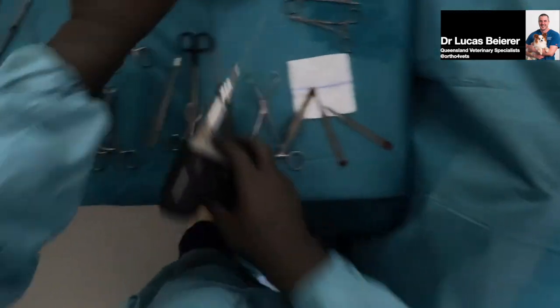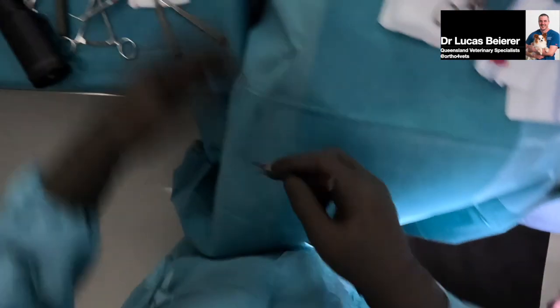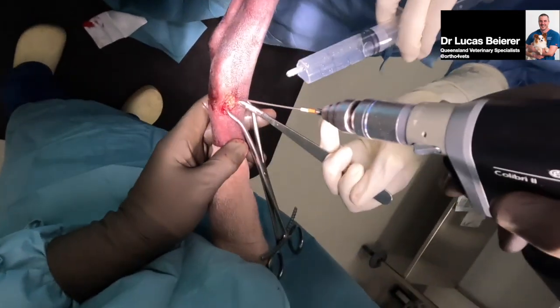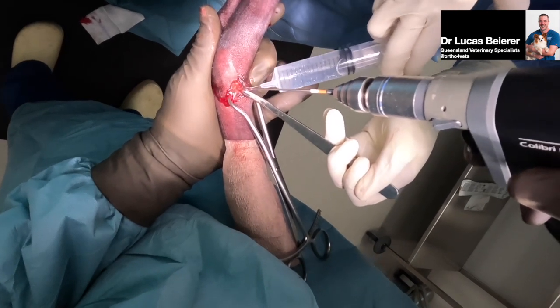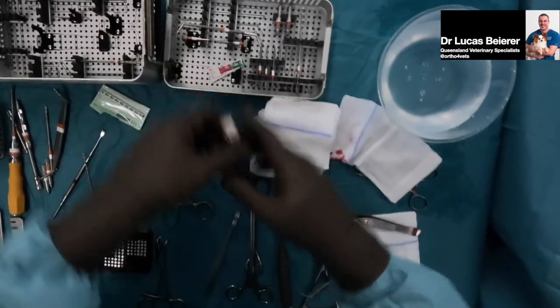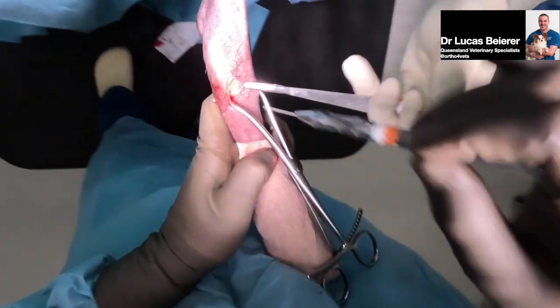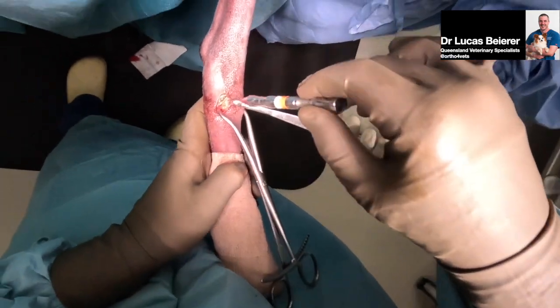More suction so we can see what we're doing. So somewhere up the top there looks good. See, that's not in much solid bone because of all the comminution that's occurred on the plantar aspect. We have pre-measured, oh, can we get our templating up please? Pre-measured the length of that screw. So that measures about 20, which I think fits with the 22 that we templated. So we'll go with the 22 cortical.